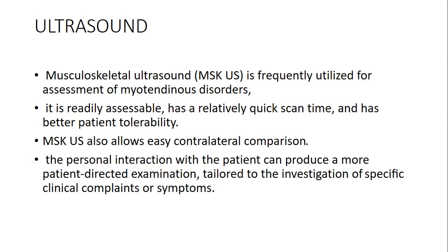It's much faster and easier. The other advantage is that you are interacting with your patient there and then, and you can tailor your study to that particular patient, putting them in the position that's most comfortable for them, which you cannot do when using MRI.